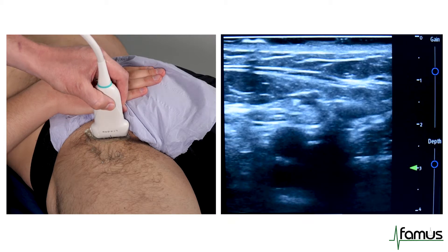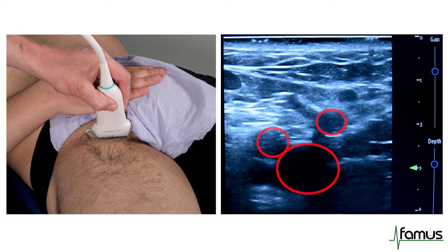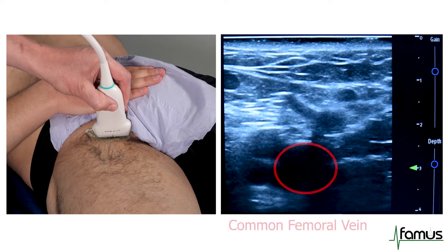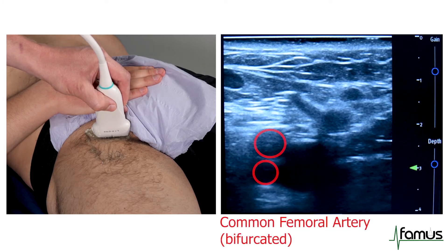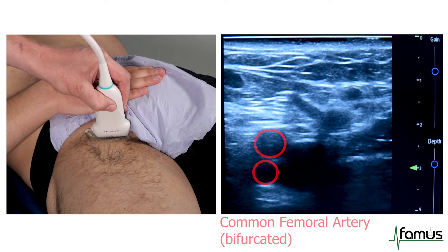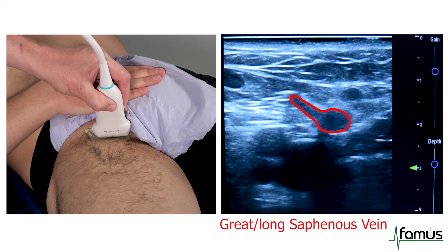As I gently slide the probe more proximally, we can see the Mickey Mouse sign come into view, which is comprised of the common femoral vein, the common femoral artery, and the great saphenous vein draining in from the right-hand side of the picture.